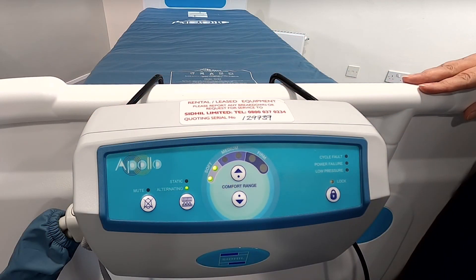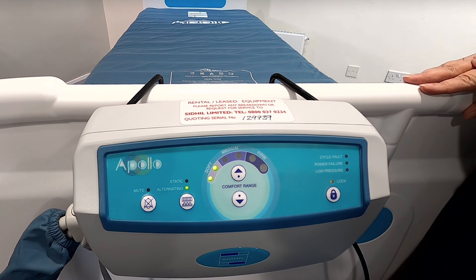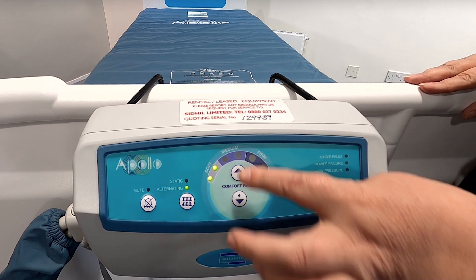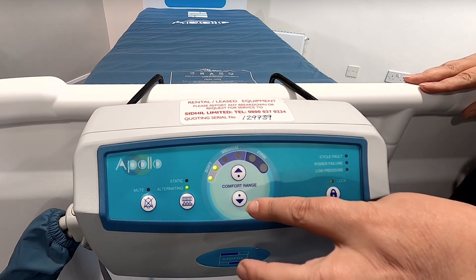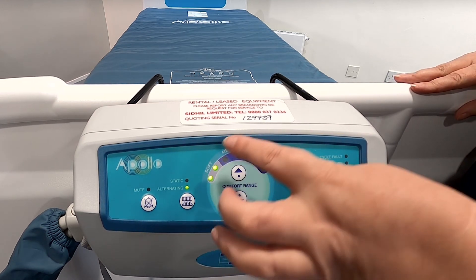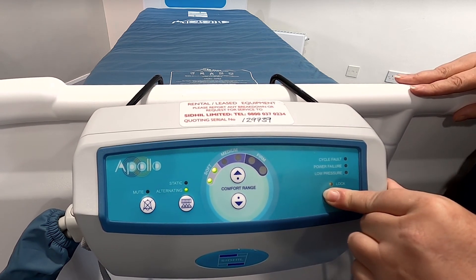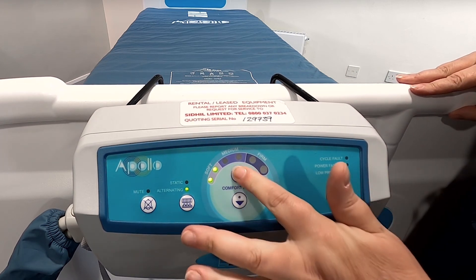The next function we're going to look at is the comfort setting. The comfort setting allows optimum comfort for patients without compromising on performance. However, you do need to use your clinical judgment when changing the pressure settings. In order to change the pressure settings, simply use the up/down buttons that you see here to select the setting you require. There are three comfort settings: soft, medium and firm. Each step increases or decreases the pressure by two millimetres of mercury.